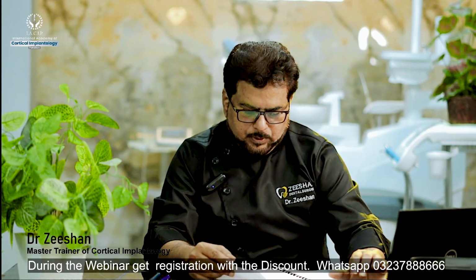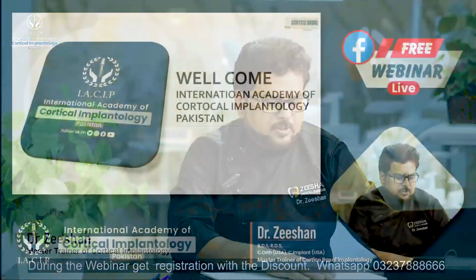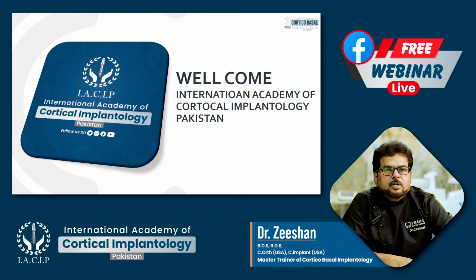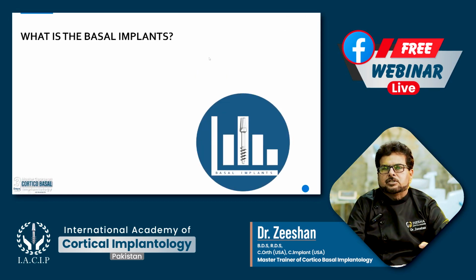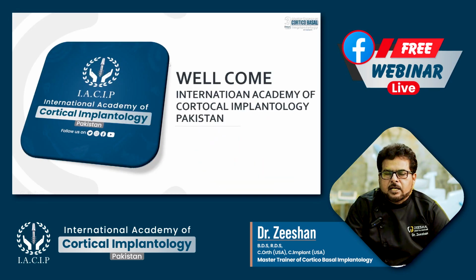The number of implants also depends on the placement of the implant. Choosing an implant system like basal implants, we want to place a number of implants to achieve primary stability. In cases where we are using more than 3 or 4 implants, we can splint them and achieve the primary stability of weaker implants.